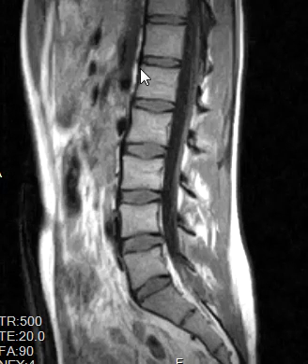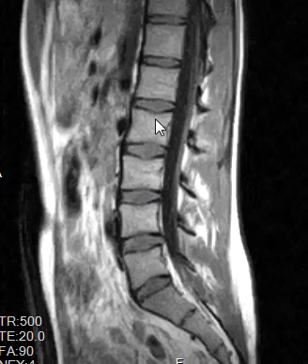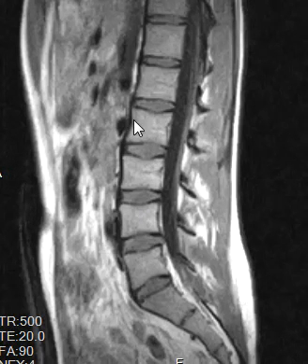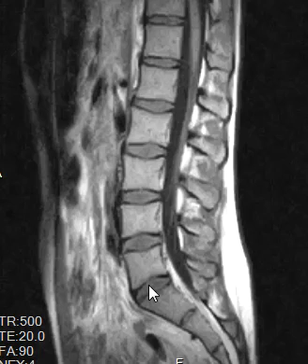In between the vertebral bodies we see these little gray things. These are the intervertebral discs, and we should see nice disc spacing — this patient has that. We should also see nice alignment, with all the vertebral bodies stacked on top of each other just right.